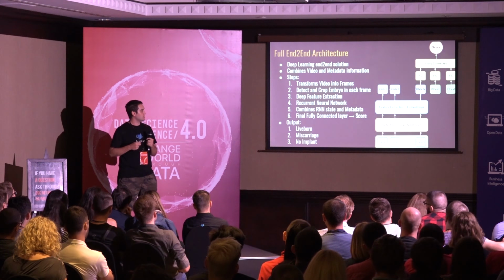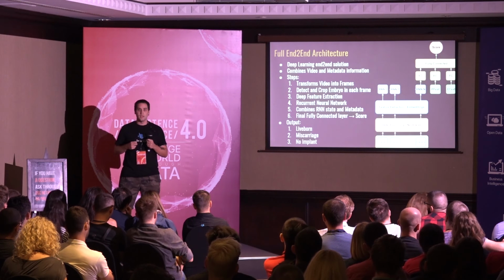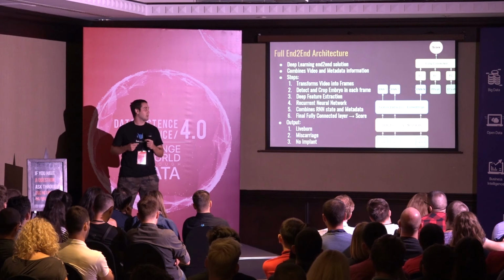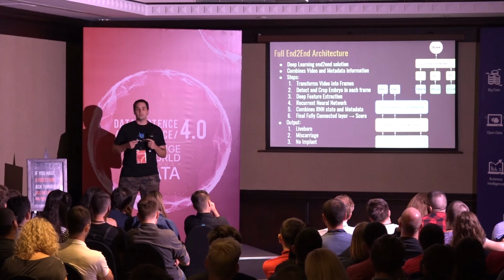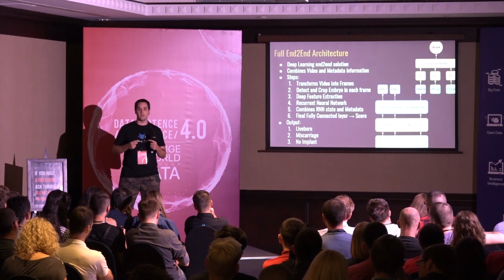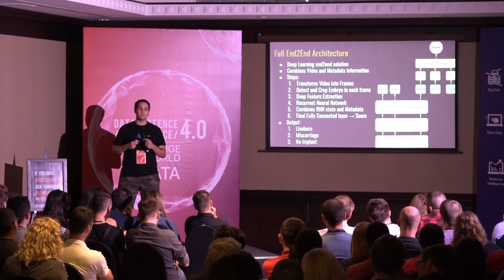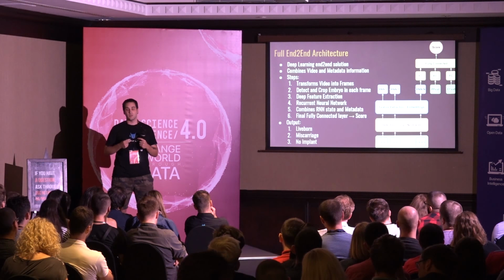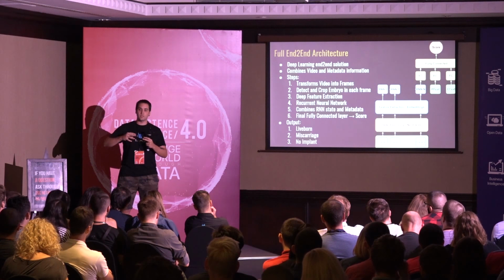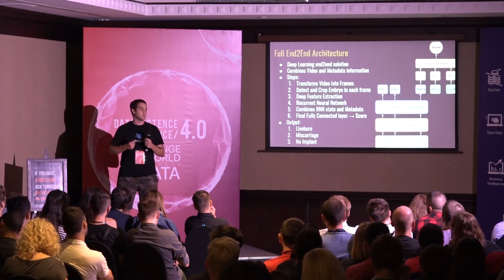And what is cool is that we want to add several data sources, like features about the mother, for example age, and other handcrafted features about the embryo. So the neural network can take all of that information and it will produce better results.